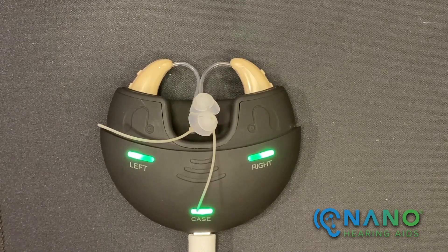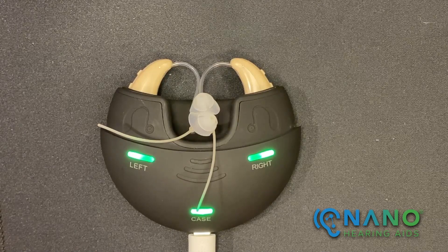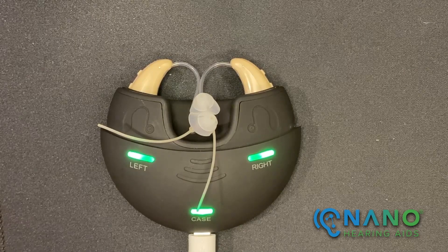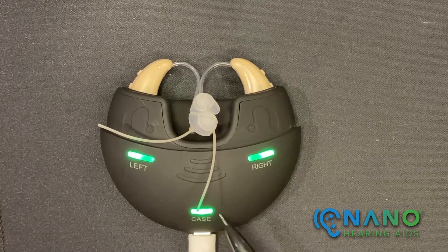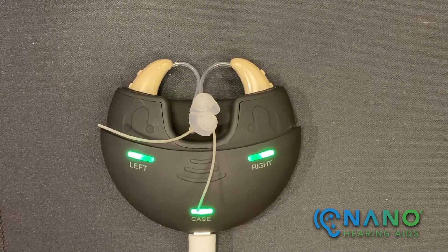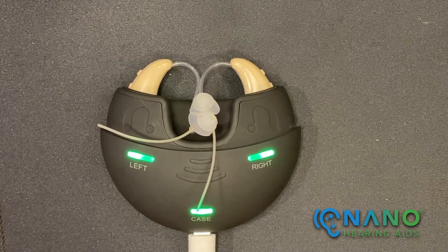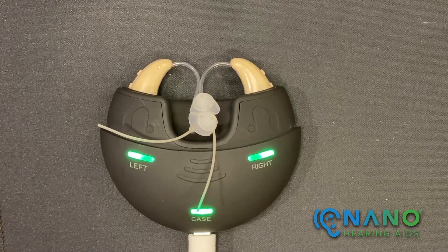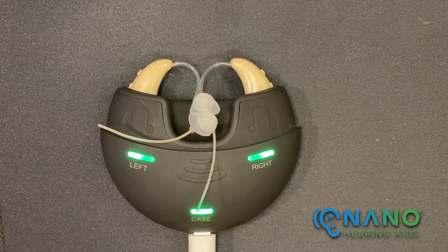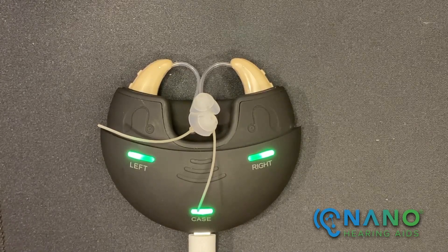You have two options for charging your hearing aids. If the charging case indicator light is green, you can charge your hearing aids without being connected to power. You can also charge your hearing aids with the case connected to power. Most people leave their charging case plugged into the wall on their nightstand so their hearing aids can charge overnight.